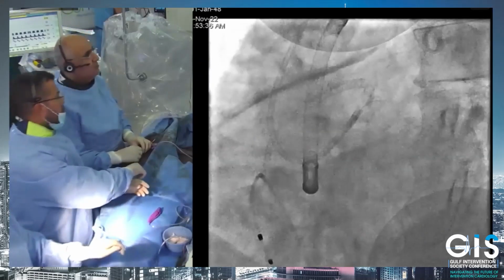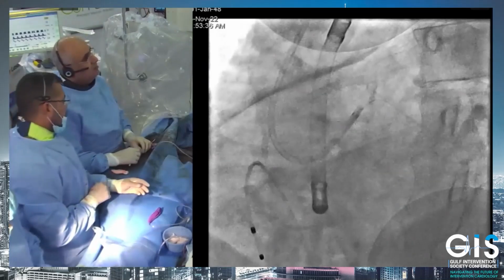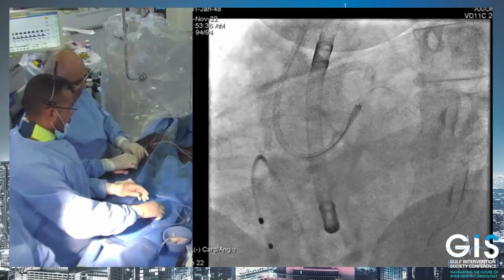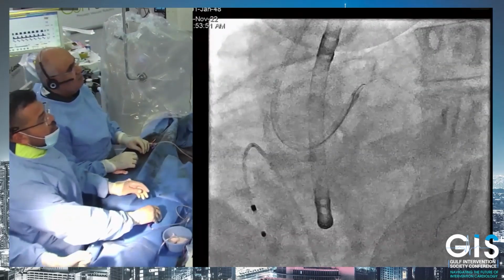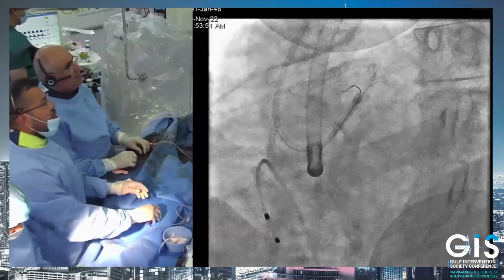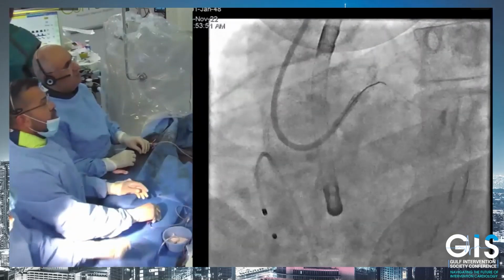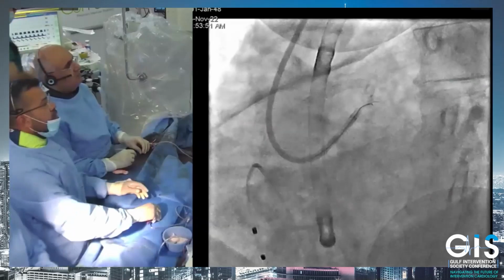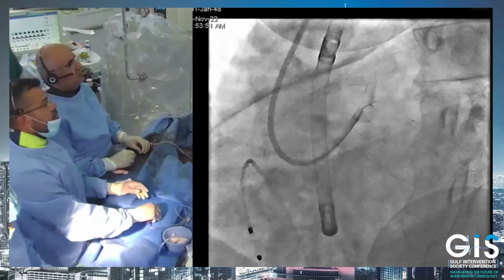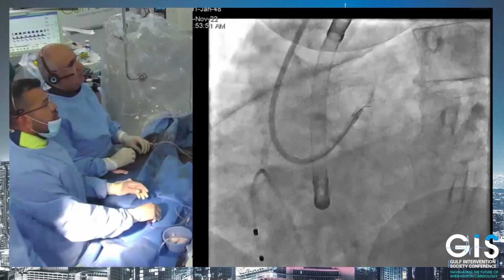Gasparin? First of all, I do agree with the procedural planning, because we are dealing with a patient with 3-vessel disease, low ejection fraction, and complex coronary lesions. So considering left ventricular assistance is a good choice, like in this case, because it's a sort of unprotected left main. I mean, it's left dominant with the RCA occluded.